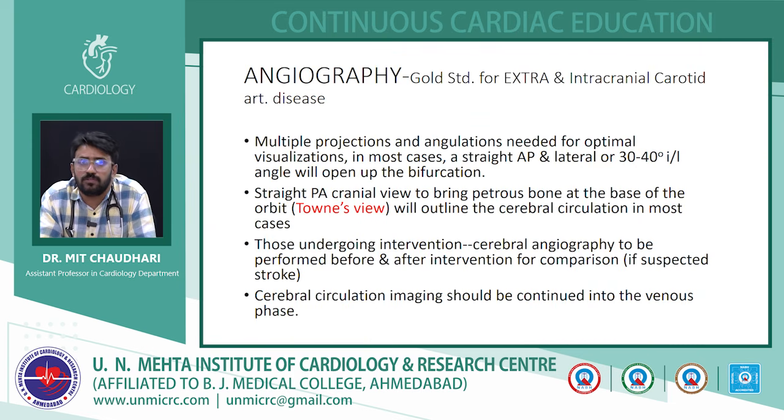On angiography, carotid angiography or digital subtraction angiography is actually the gold standard to define the internal carotid as well as the external carotid, and for extracranial as well as intracranial carotid artery disease. We have to take multiple projections, as I have already highlighted: a straight AP view, a lateral view, or a 30 to 40 degree ipsilateral oblique view to open up the bifurcation more clearly.